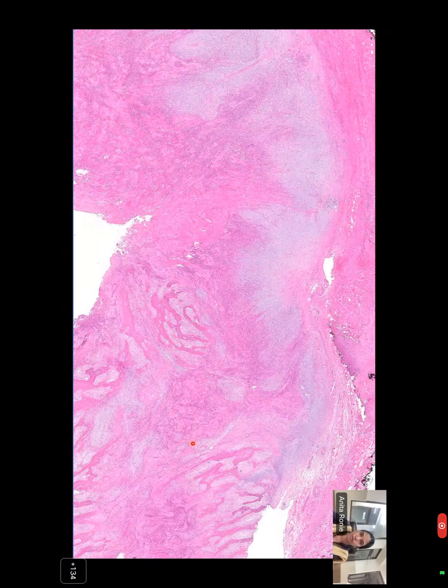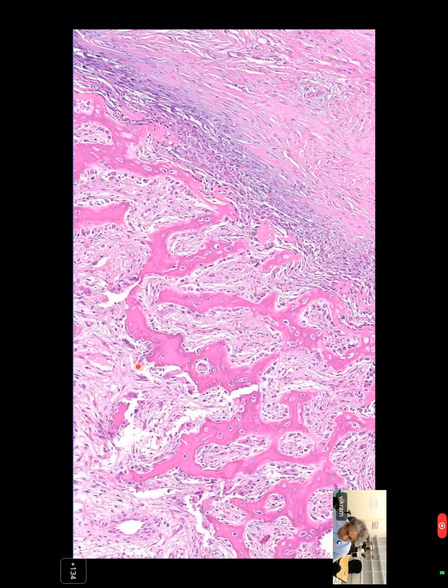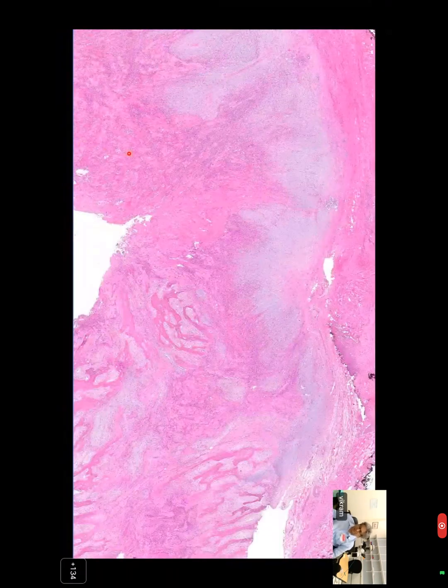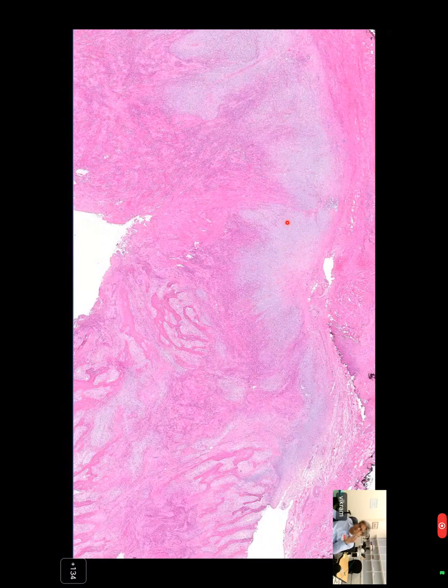That's all right. Although there is a lot of bone, if you look at the bone itself, you see there's actually a fair amount of osteoblastic rimming, right? See right here, that's osteoblastic rimming. That should have stopped you from making a diagnosis of an osteosarcoma. Osteosarcomas don't typically have this classic osteoblastic rimming. The low power appearance is very helpful as well. So the center of this lesion looks very immature, and the periphery looks like bone. But I think the thing that confused the outside pathologists in this case is that it looks very cellular and sort of bluish at the periphery.